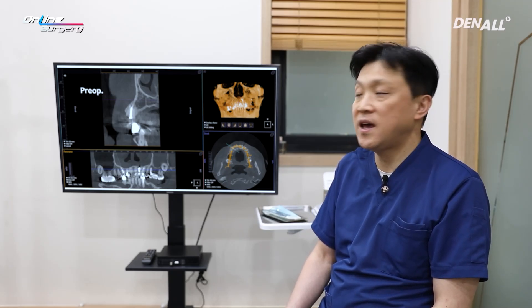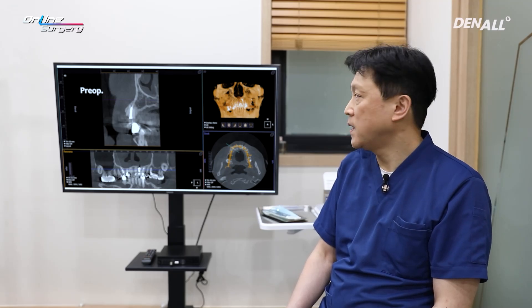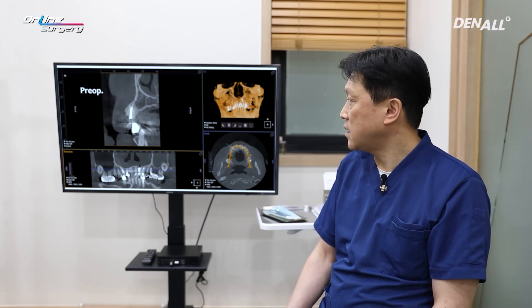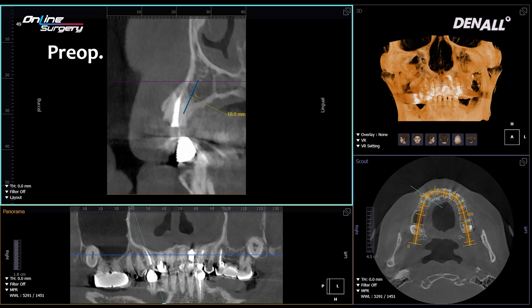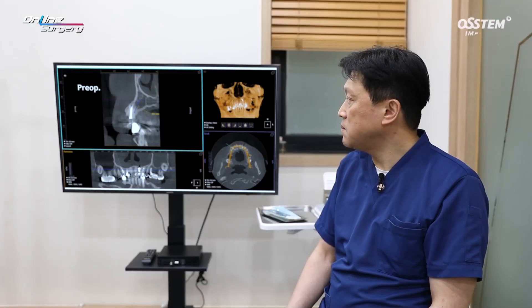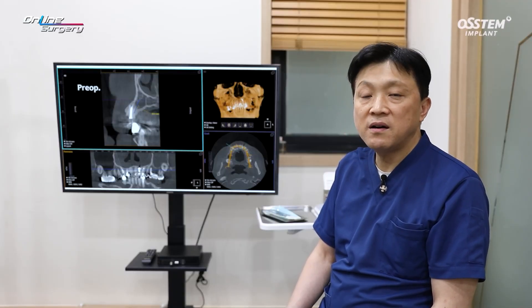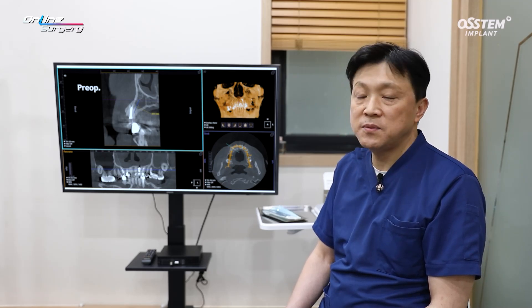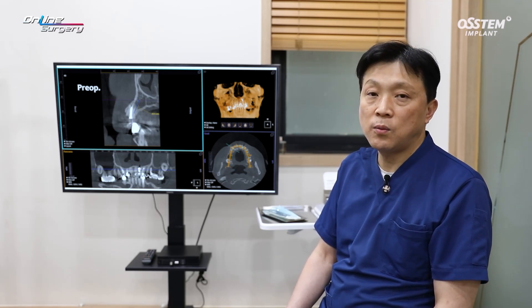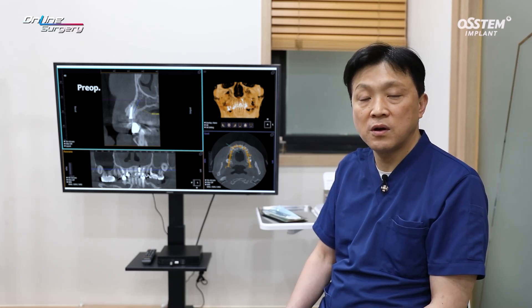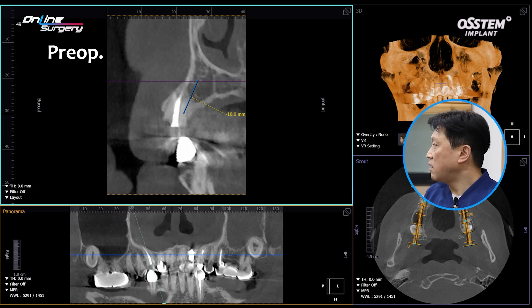In the case of a canine (K9), when you do immediate implant placement, we need to be very careful about the implant placement angle. We need to place the implant more palatally and adjust the angle so that it is more labial. Regarding length, about a 10 mm implant would be appropriate. Using a longer implant increases the high possibility of fenestration occurring in the apical portion, so extra long implants would not be wise.